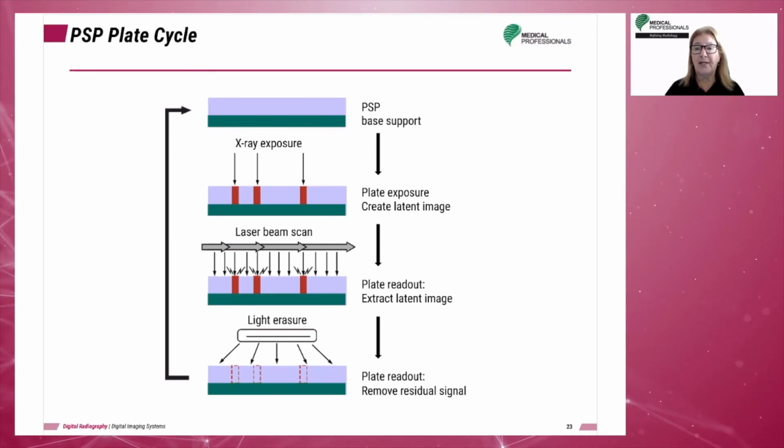CR imaging plates are more sensitive to background scatter and should be protected prior to use, and they should be erased if they have been stored for any length of time.